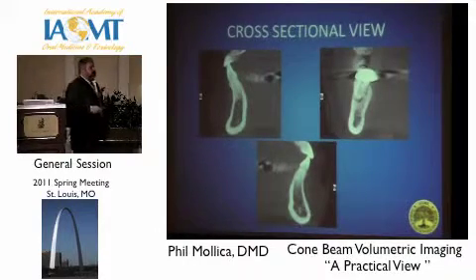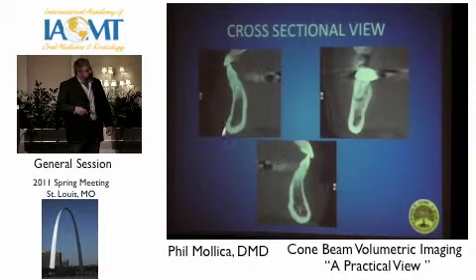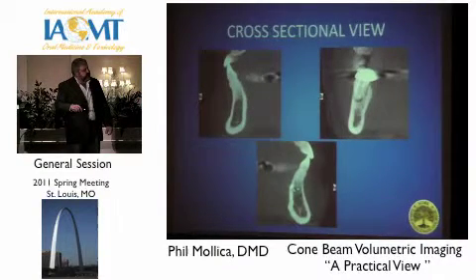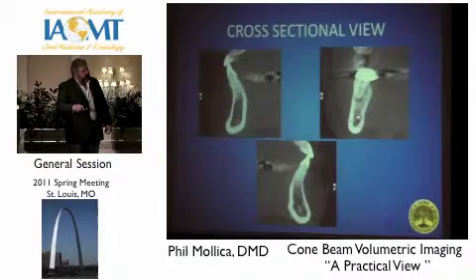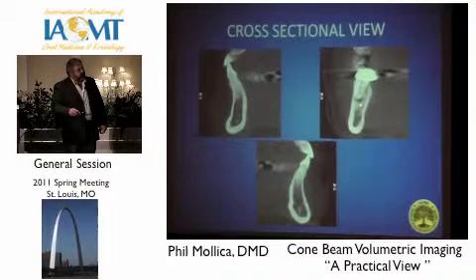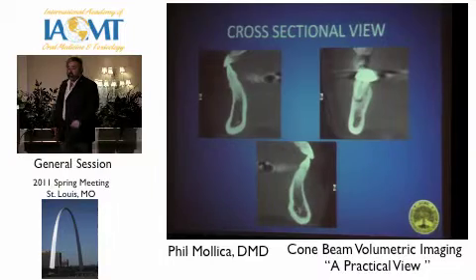I love this stuff. Cross-sectional views. And we can actually get it down to where a couple of little millimeter slices are smaller. We can actually take sectional views of the dentition itself. Look at the cortical plate. Look at the medullary canal. Look at the inferior alveolar neurovascular bundle. Hey, look at this root canal. Uh-oh, what's that? They didn't use ozone.